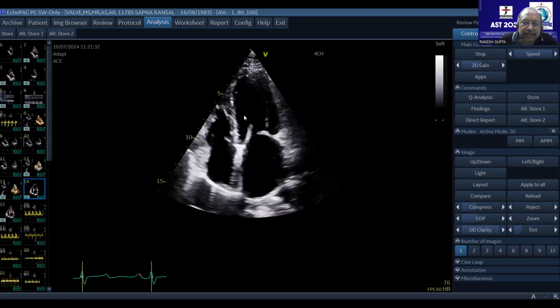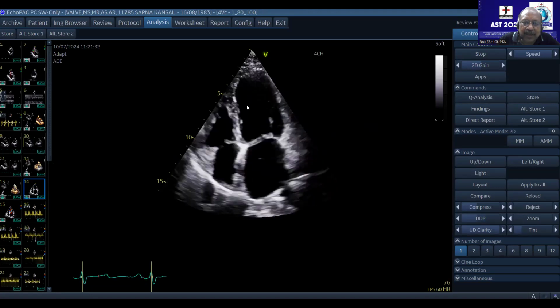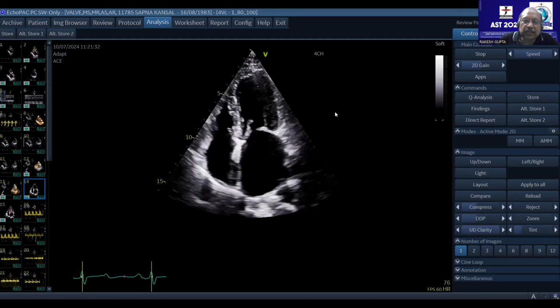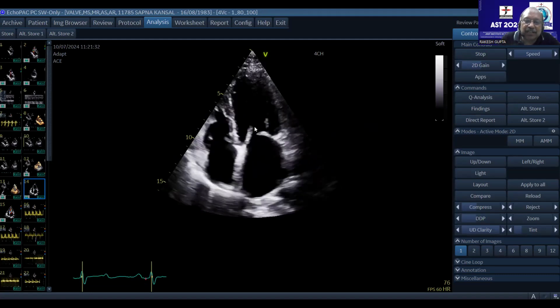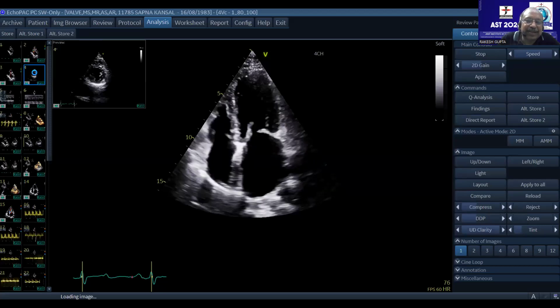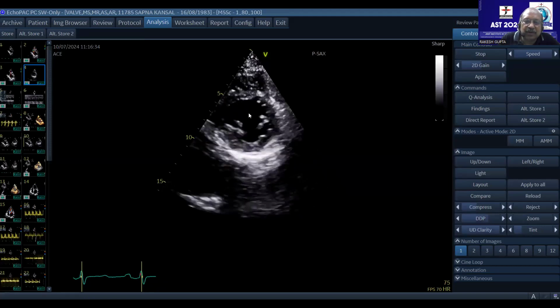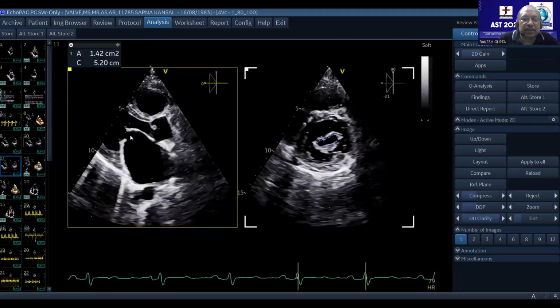If I'm cutting at the aorta and papillary muscle level, what is the mitral valve leaflet? We have to go from papillary muscles towards the aorta. The first structure we encounter is the mitral valve leaflet tips. In the parasternal short axis view at the aorta, going towards papillary muscles, the first structure you will encounter is the mitral valve leaflets, which is shown over here in this particular technology by cutting at the tip of the mitral valve.